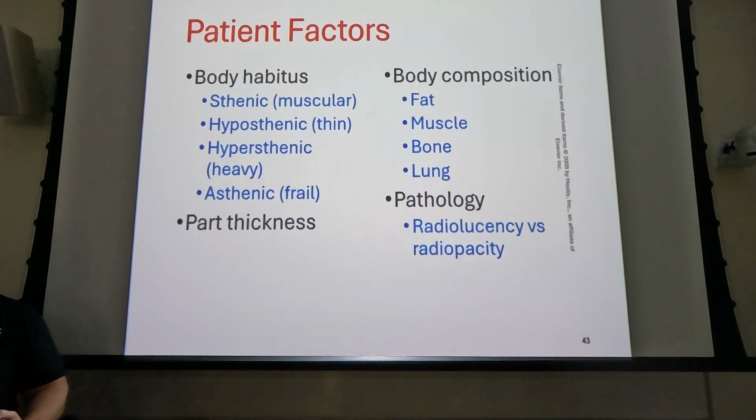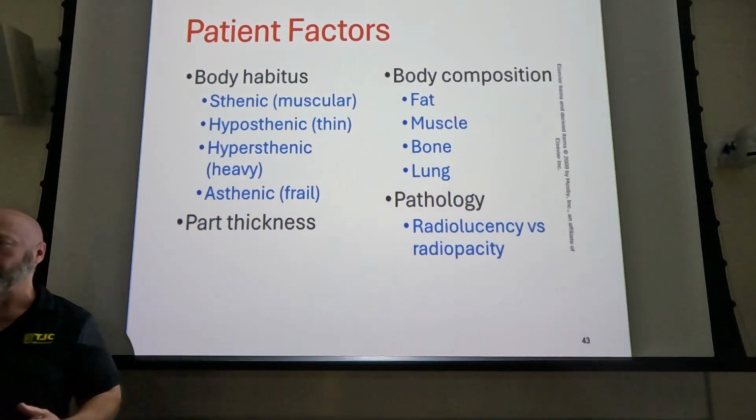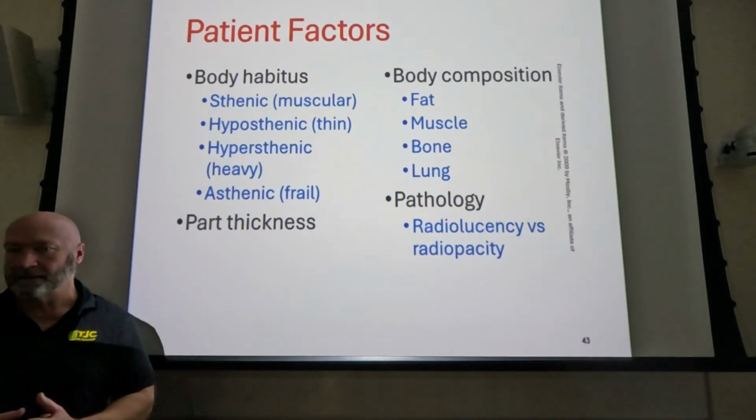Now, if you have an additive or destructive disease that added or removed bony tissue, now you've got something different. If you've got a patient with osteopetrosis, Paget's disease, acromegaly, something that added a lot of bony tissue, you might want to increase your KVP in that case, okay?